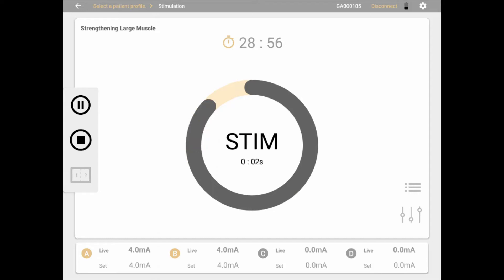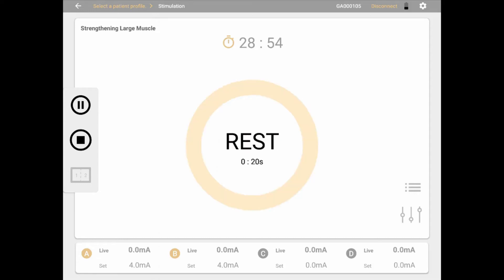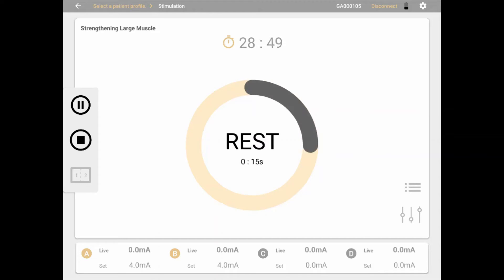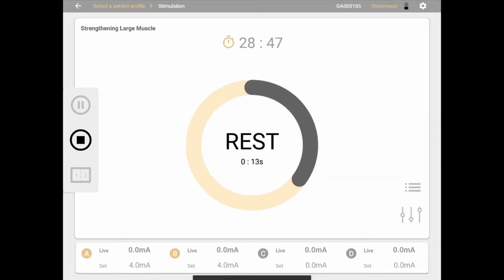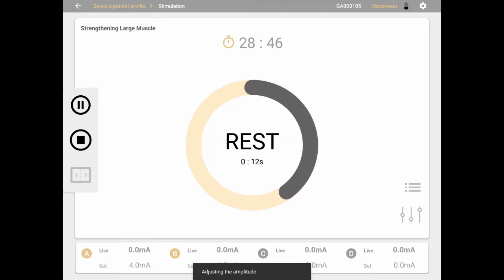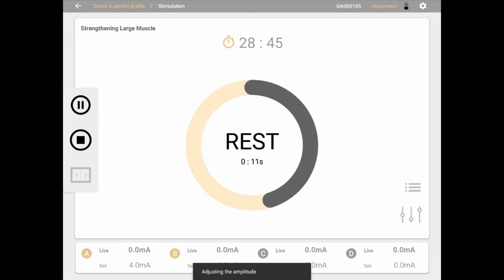You may also adjust the amplitude values while in session. This is done on the Mionics device by selecting the channel to adjust, and then using the up or down arrows, or a circular swipe motion, to increase or decrease the amplitude.